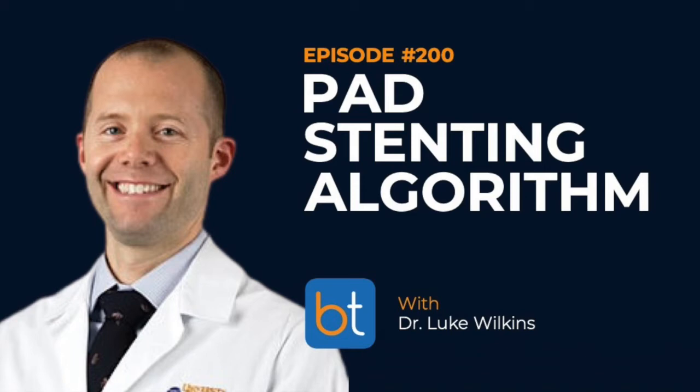So is it still reasonable to assume that your distal embolic rate is going to be high with other devices such as directional atherectomy, when you compare it to something like orbital atherectomy? I'm not really sure, but I still use this rule of thumb because it seems that would make sense, that you're increasing the risk with these longer lesions. And doing directional atherectomy over greater than 10 centimeters takes a long time, and so I get pretty impatient. That's the other reason, from a time perspective, it gets pretty annoying. Okay, so coming back to the flow chart.